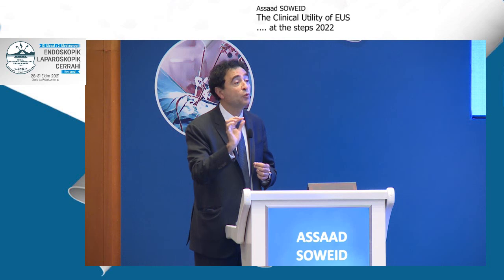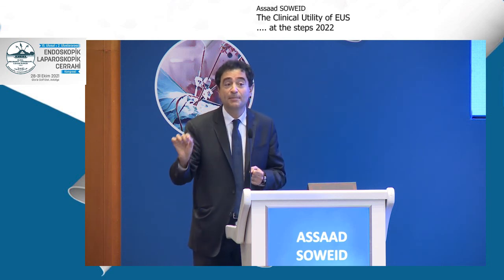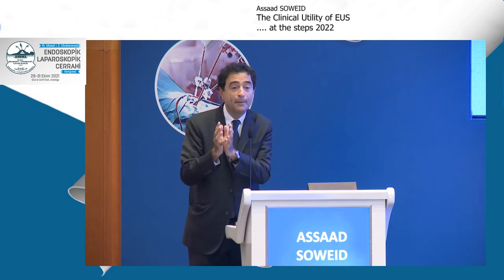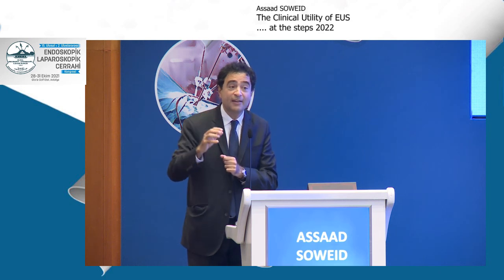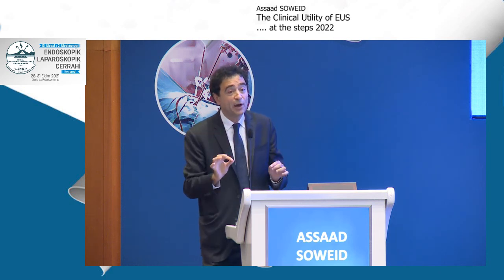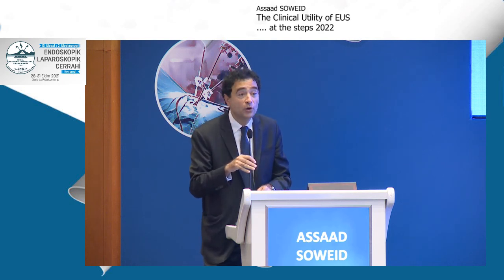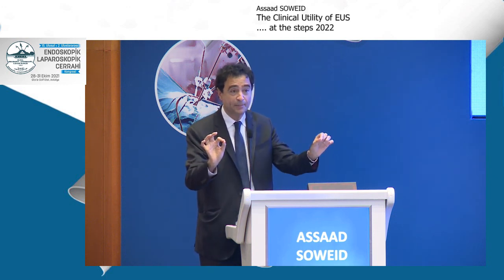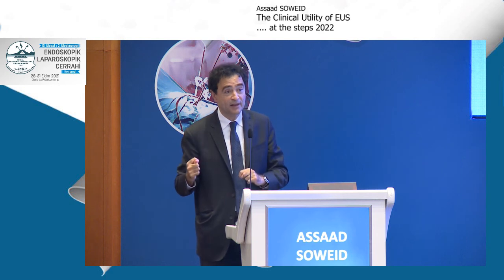They showed, at least in a few case reports, that if you do a transgastric biopsy, it can produce some seeding. So the risk is low, but it is there. So if it's a body or tail lesion, specifically a cystic lesion, there can be seeding. It goes back to the risk and the benefit, but at least data-wise, it is safer, and there is a study done at Duke in North Carolina that looked at patients who had CT-guided biopsy versus EUS-guided biopsy in all of the pancreas, and the seeding is much less with an EUS-guided biopsy.